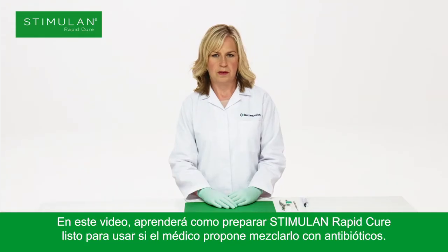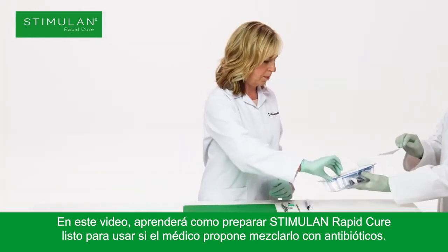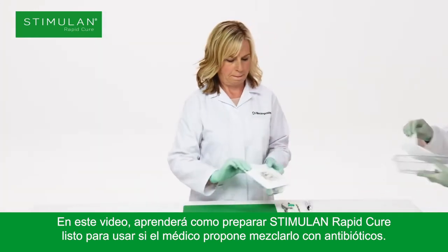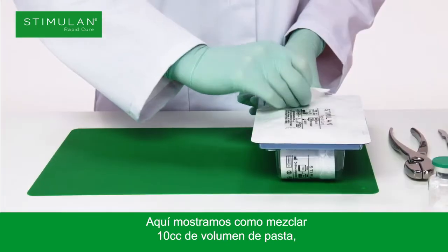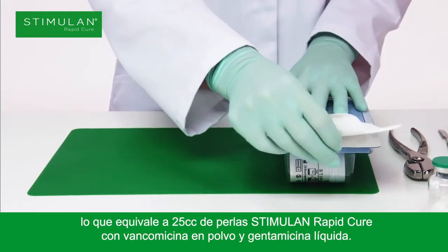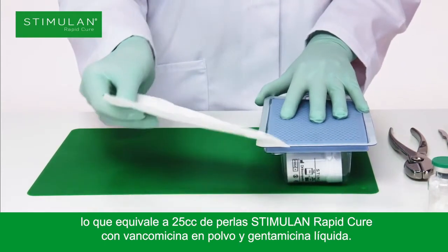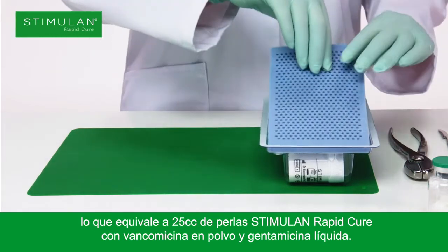In this video you will learn how to prepare Stimulan Rapid Cure ready for use if the physician is proposing to mix with antibiotics. Here we demonstrate mixing 10cc paste volume, which equates to 25cc bead volume of Stimulan Rapid Cure, with vancomycin powder and gentamicin liquid.